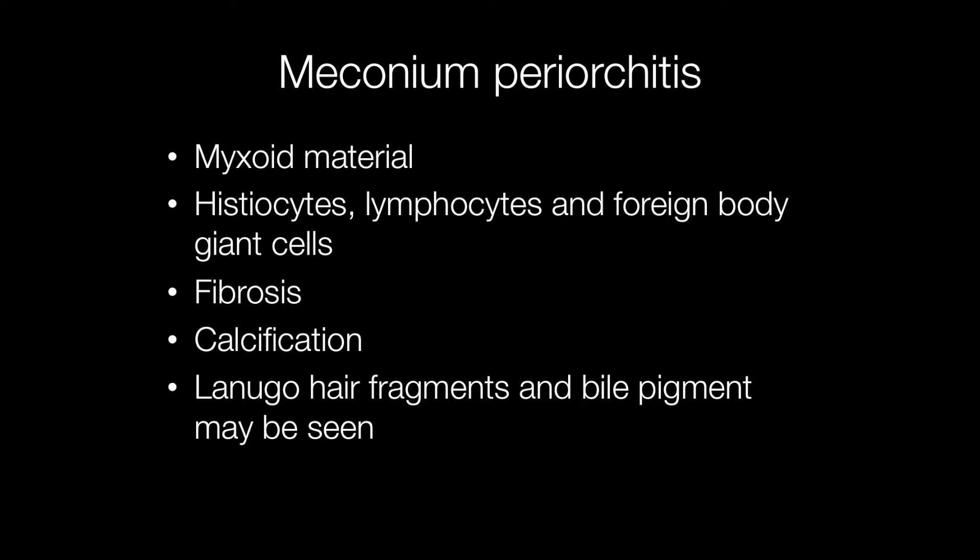Histologically, meconium periorchitis is characterised by myxoid material containing histocytes, lymphocytes and foreign body giant cells. There are areas of fibrosis, areas of calcification, and lanugo hair fragments may be seen. Bile pigment may also be present.